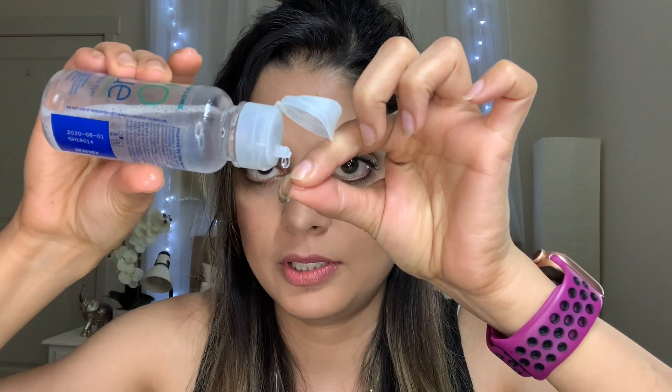Now it's time for the next lens. I will remove the next lens. I have already removed it, but I will still wash it with my contact lens solution — because I had forgotten this step earlier.